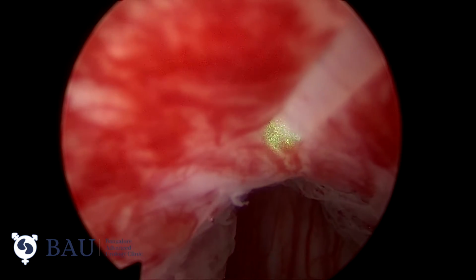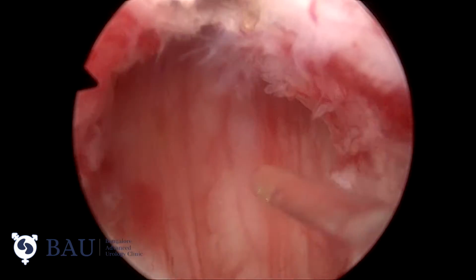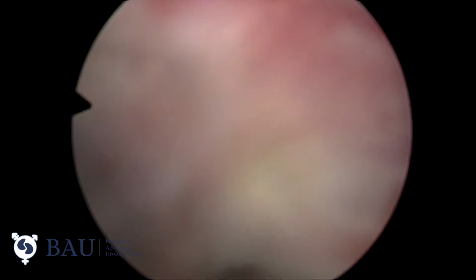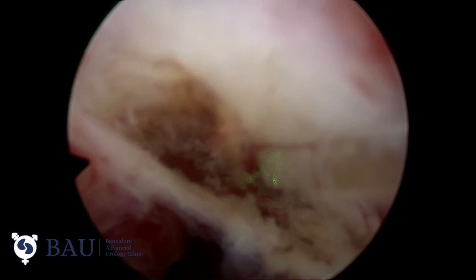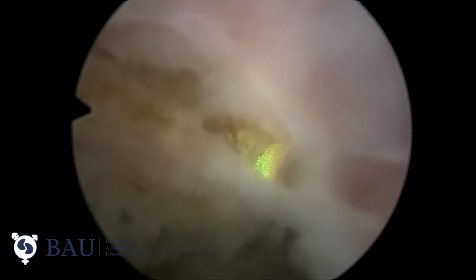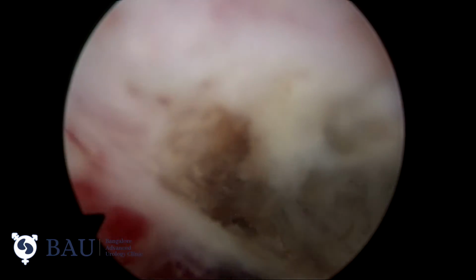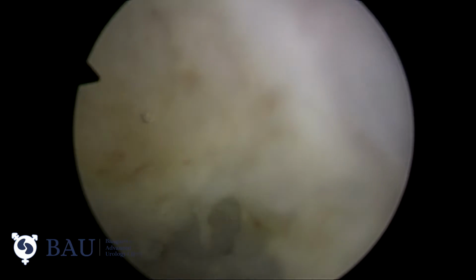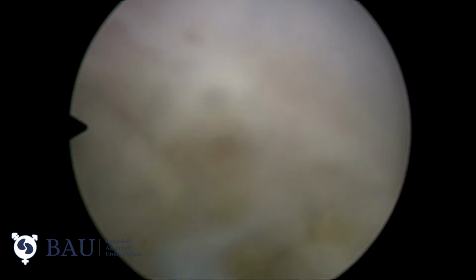Now I am marking the anterior part of the apical limit. Once I mark, I join the mucosa of that apical anterior mark and the posterior dissection. This will completely release the mucosa from the prostate, and when we manipulate the prostate gland, it will not exert any tension on the mucosa. By that way, it will avoid any tension on the sphincter. This will help in gaining early continence.